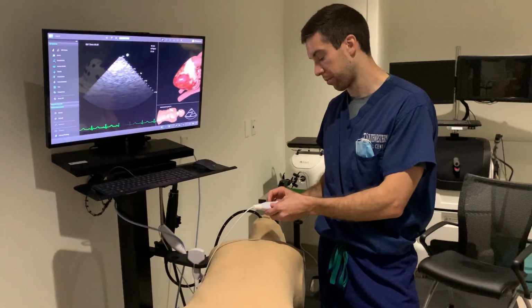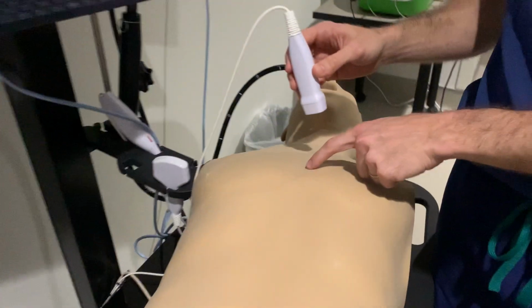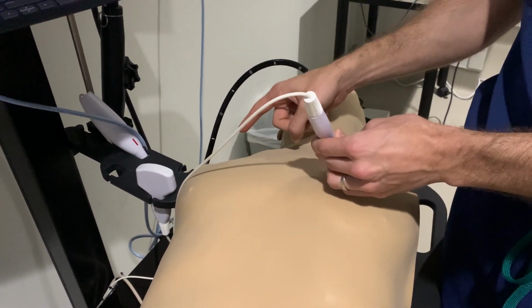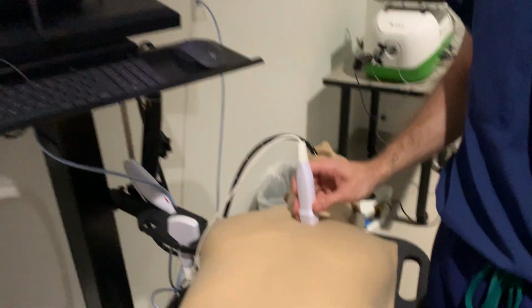So as I said, we'll start with the parasternal long view. That just means we put the indicator probe on the patient's chest. It's the left parasternal space, and you want the indicator pointed towards the patient's right shoulder. It's about the third or fourth intercostal space.